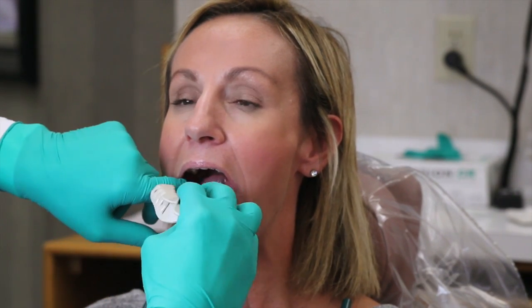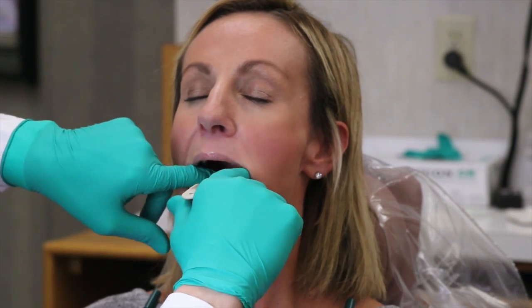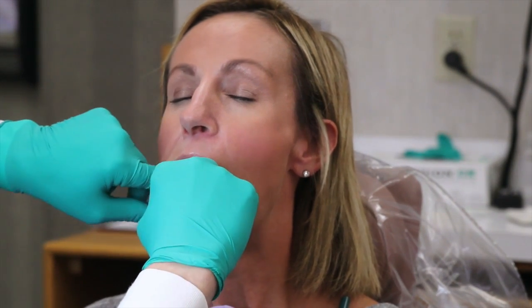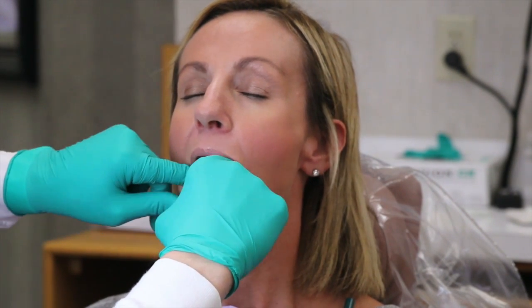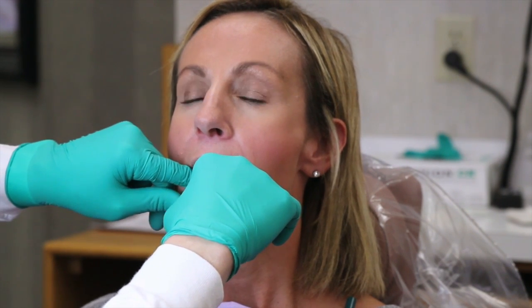So after doing this, what we're then going to do is the tray modification that we demonstrated in the previous segment. We've done that, and I'm going to take the trays and check them in. What I want to see here is, do they extend distally far enough? I'm going to get a sense of the vestibular extension, although as you will see, with the viscosity of the alginate we use, it's very forgiving on the vestibular extension. But I also want to see, are we too tight? We want about 1/4 of an inch of room all around.